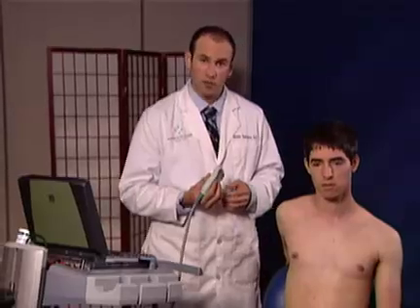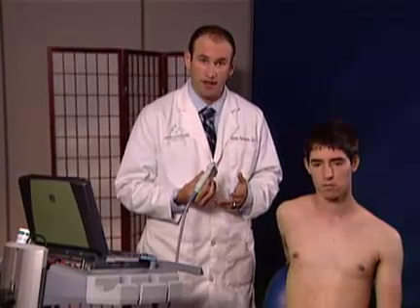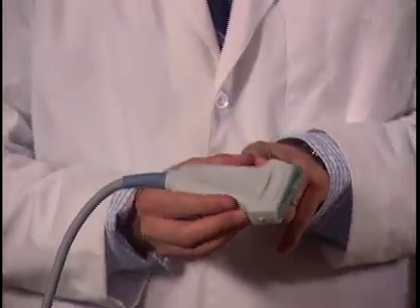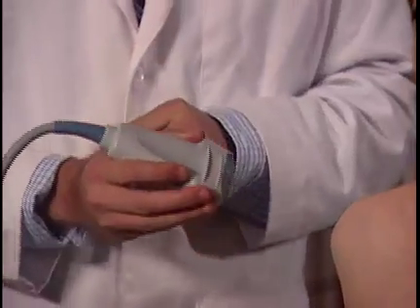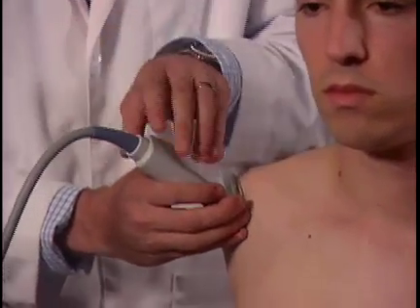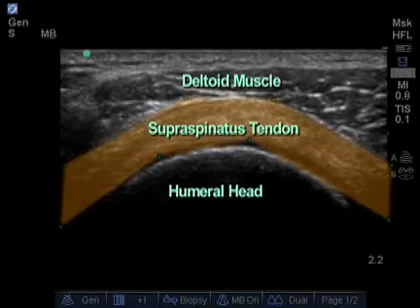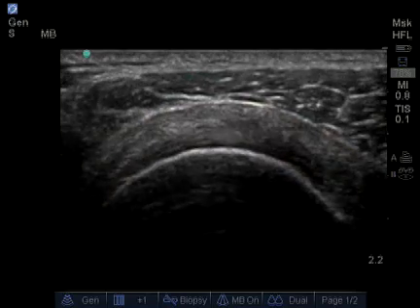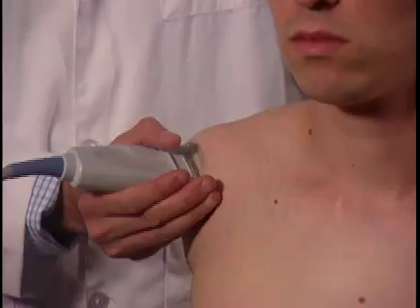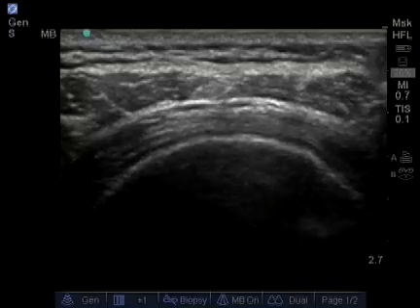There are two views we're going to look at for the supraspinatus tendon. First, where we see most pathology, will be in cross section. With this technique we keep the notch of the probe faced upwards and we're going to angle the probe diagonally down towards the navel or belly button. Maintaining contact on the patient, I visualize the supraspinatus tendon and its fibers, examining it in both directions to clearly rule out any pathology, gently rocking the probe side to side following the length of the fibers.